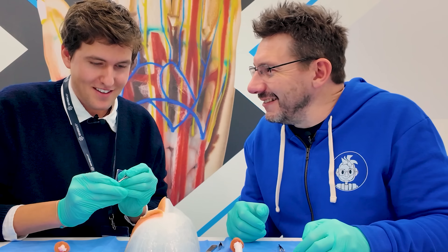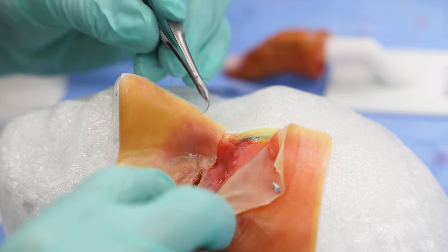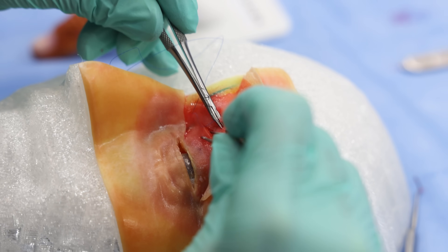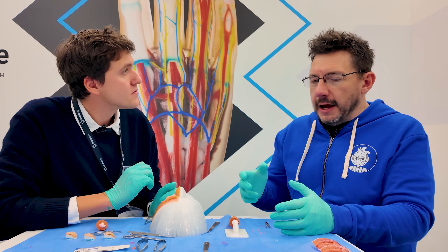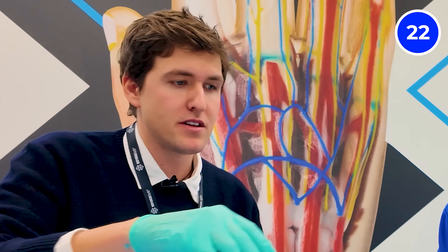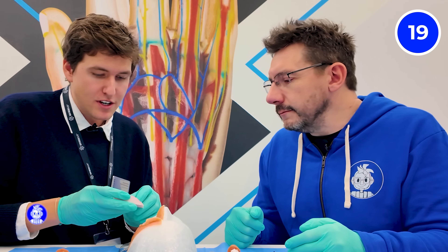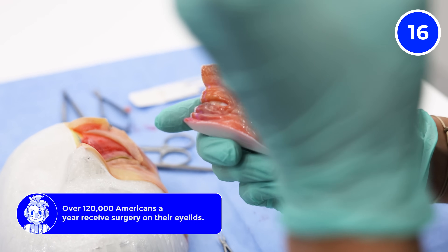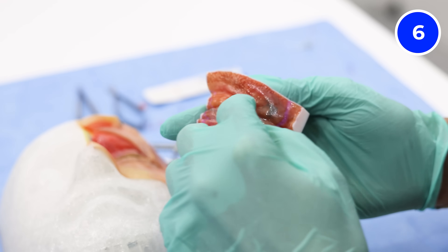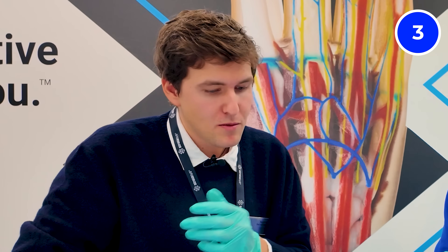Alex has done this a number of times in development. These models really allow the surgical team to practice different methodologies, different cut patterns, and different suture patterns. You can also add diseases - like a tumor somewhere. There are attachments for different surgeries: fatty tissue that's too big that needs to be released, or traumatized areas. If there's too much pressure - if the eye is growing - you need to release pressure from the rim of the eyelid. You can prepare as a doctor much more thoroughly and feel more comfortable going in.